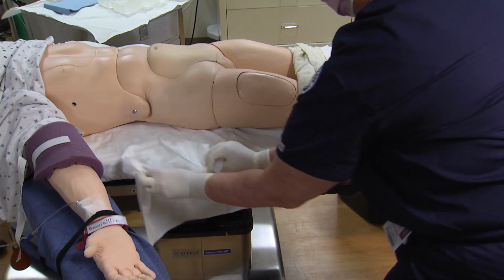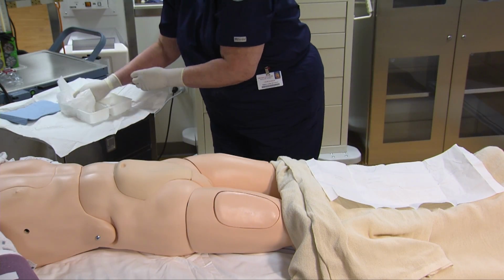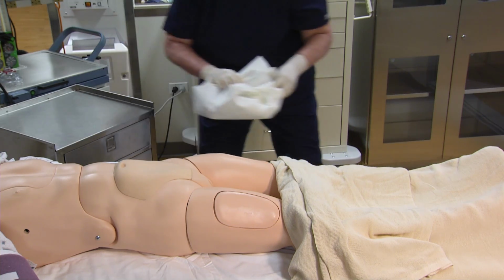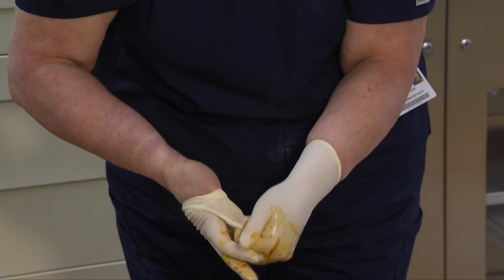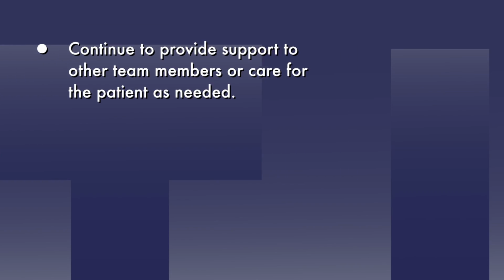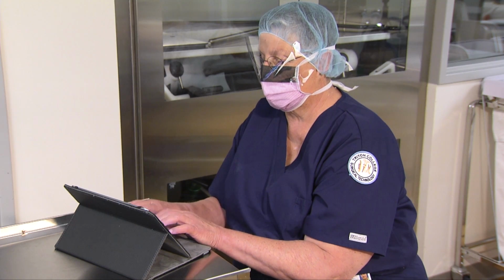It will be necessary for you to walk around the table to remove the distal drape. Remove and discard the barrier drapes from the periphery of the prepped area without disrupting the prepped site. Discard the used supplies and remove your gloves using the glove removal technique that you learned previously. Continue to provide support to other team members or care for the patient as needed. Wash your hands as soon as practical, and remember to document the procedure in the patient's chart.